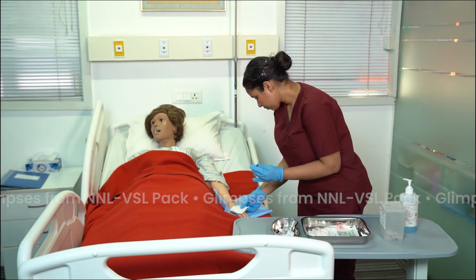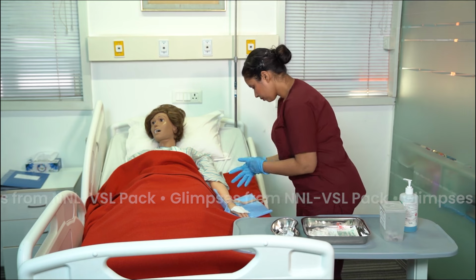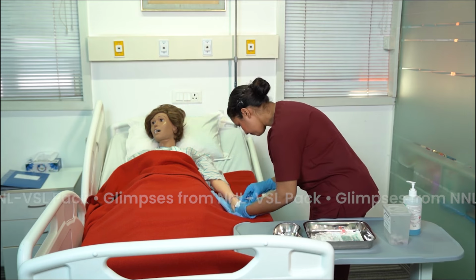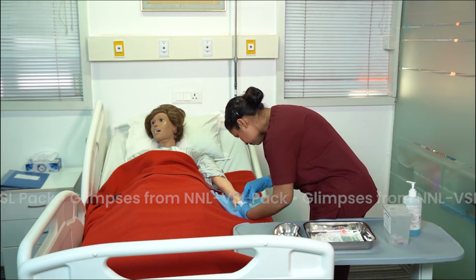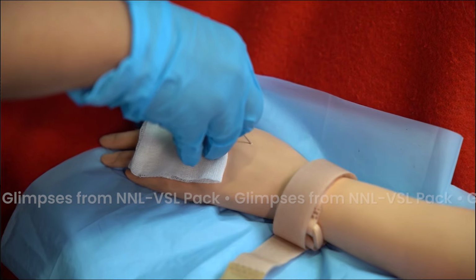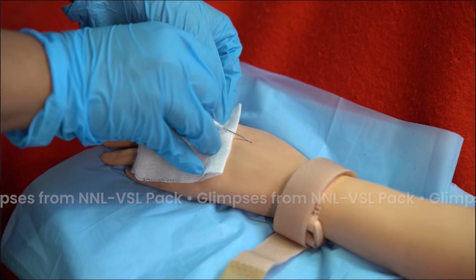Hold the cannula in dominant hand, stretch the skin over the vein to anchor the vein with your non-dominant hand. Insert the needle at an angle of 25 to 30 degree to the skin. Observe for blood in the flashback chamber.